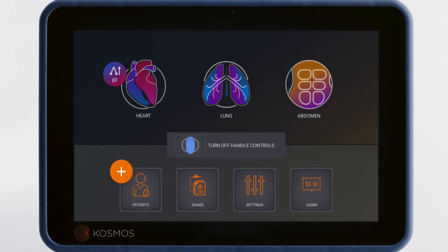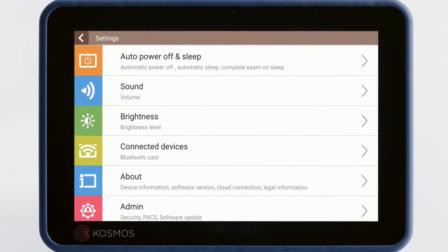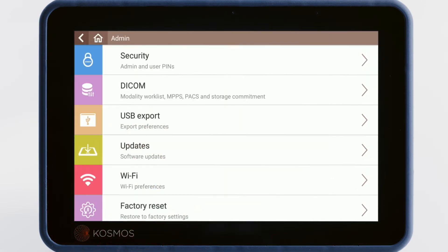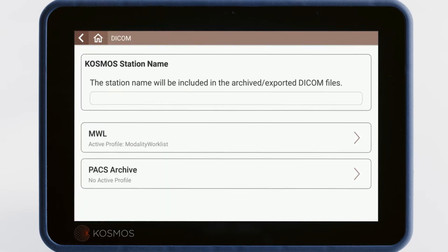To get started, tap on Settings on the home screen. Scroll down to the Admin button on the menu. In the Admin menu, select DICOM. In the DICOM screen, you can name this Cosmos' station, which will show where the images came from in the PACS system.